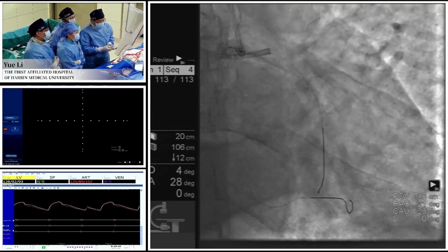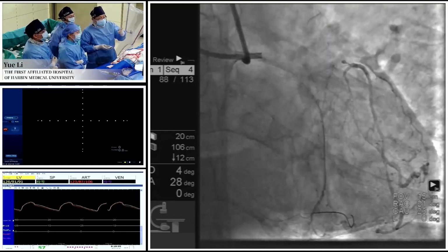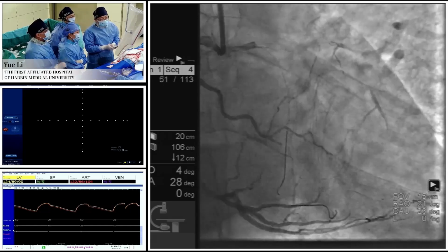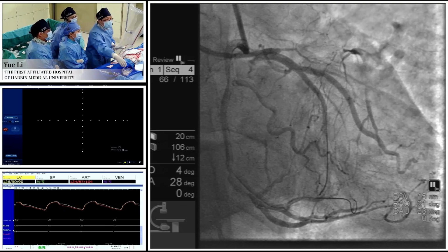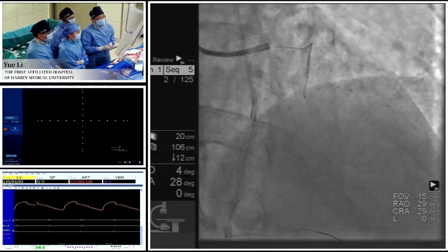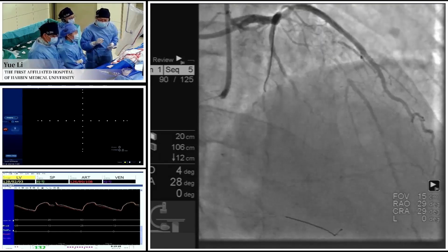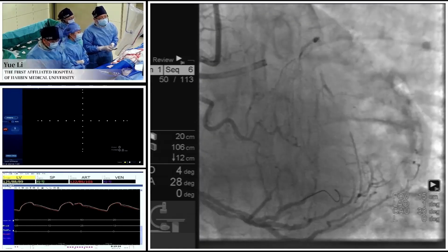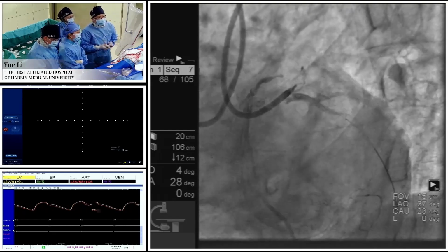So we do the bilateral angiogram, and we can see, just like Dr. Jing told, there is no very clear stump. So which one is the real ostium? We couldn't be sure, but certainly we could use IVUS to check the ostium of the LAD. But one limitation is that the side branch is too small. Sometimes the common IVUS catheter couldn't be advanced into it. Okay, that's the dual angiogram. We can see this should be the slide.